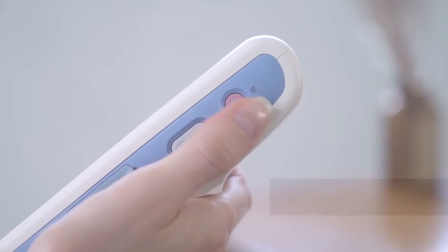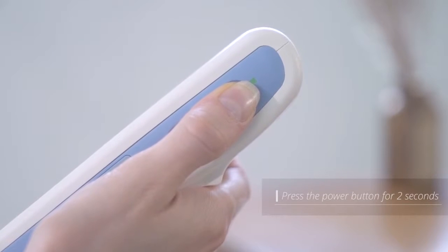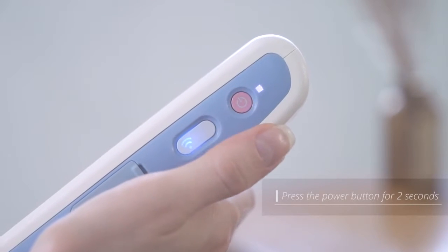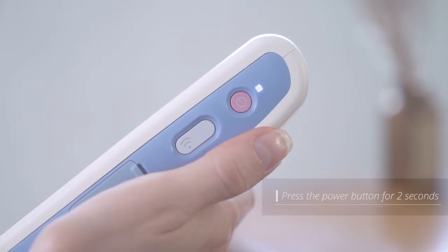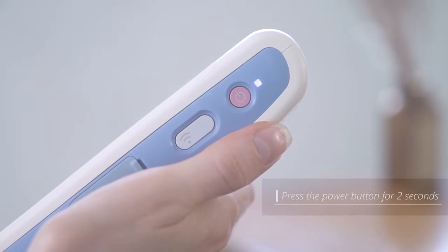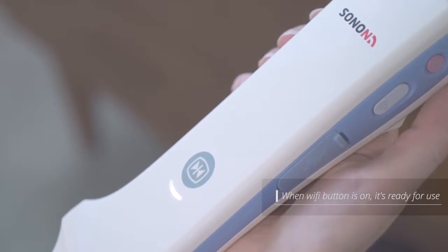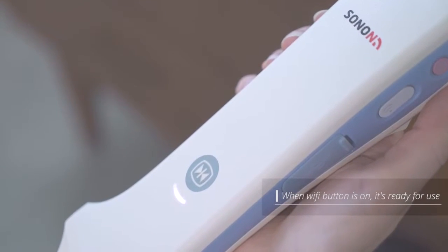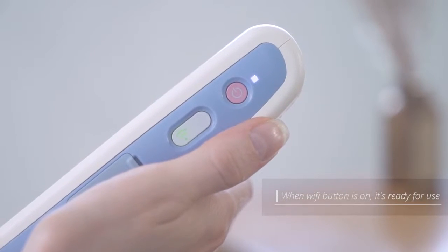Press and hold the power button for about 2 seconds to turn on the device and it will automatically activate Wi-Fi. The LED indicator on the top of the product is now blinking and is now ready for use.